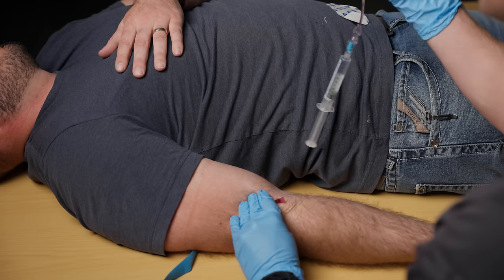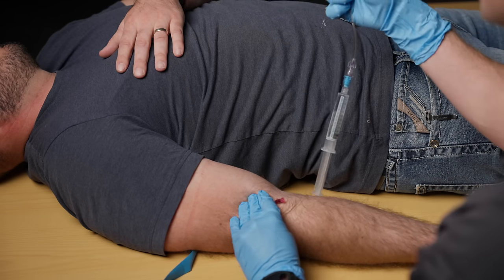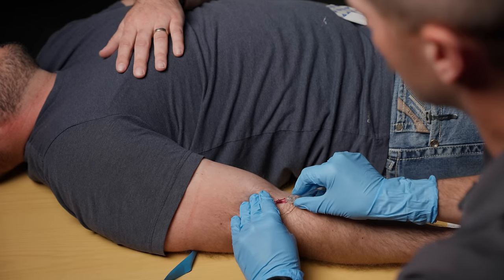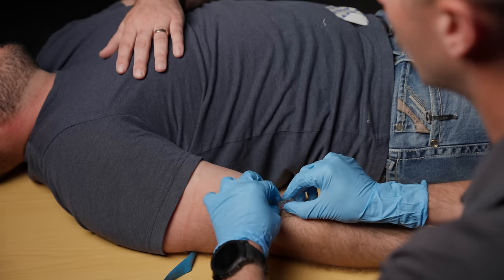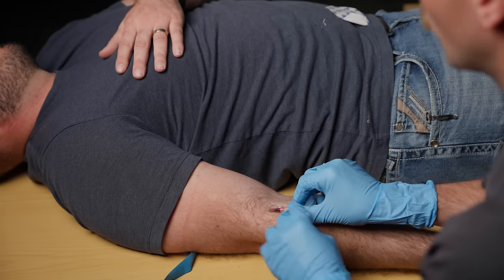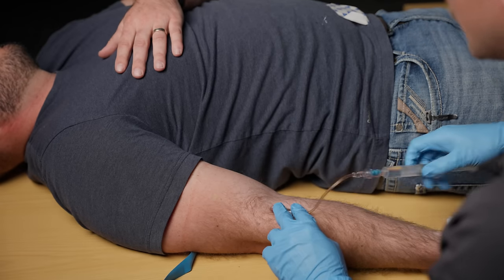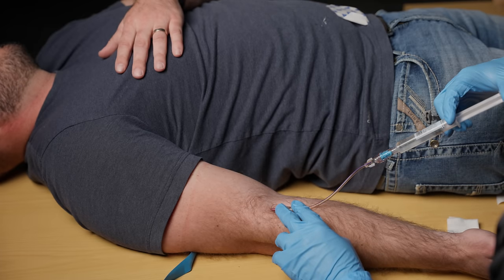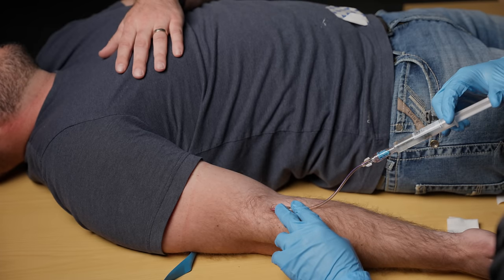I'm going to take the J-loop with this hand — I don't want to touch the end once this cap comes off, so I'm going to be careful with that. I'm going to take this end, insert it onto that hub, hold this with my hand down, and now I'm going to flush 5 to 10 mls of saline through this IV just to make sure it's a good IV.